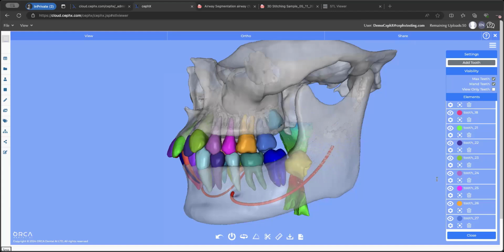Maybe we can talk about which machines we integrate with? Sure. So yeah, we integrate with a number of different types of machines. Firstly, anybody can send us an exported DICOM from any machine. So that's always a default. Every machine has the ability to export a DICOM as a DCM file, or as a directory, or as a zip file, and that can be uploaded.